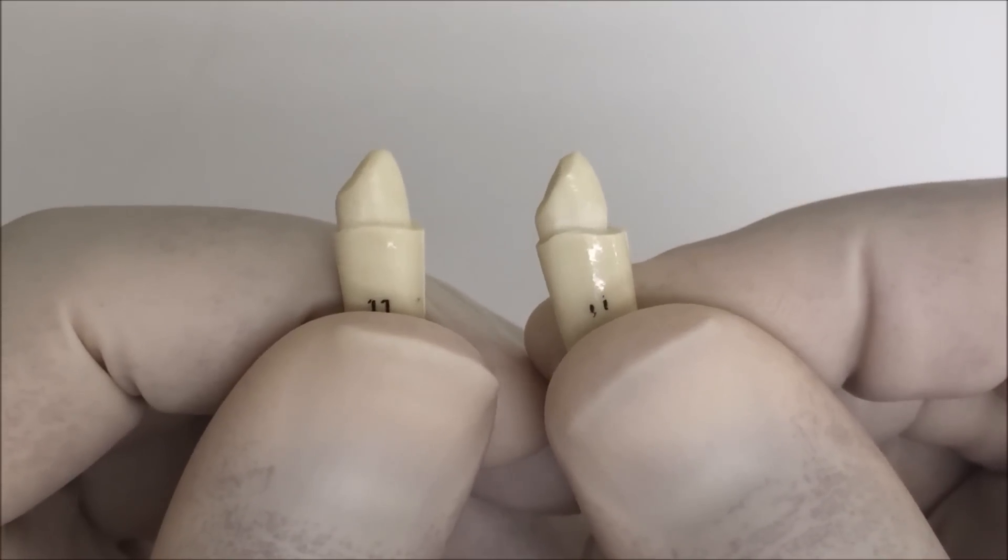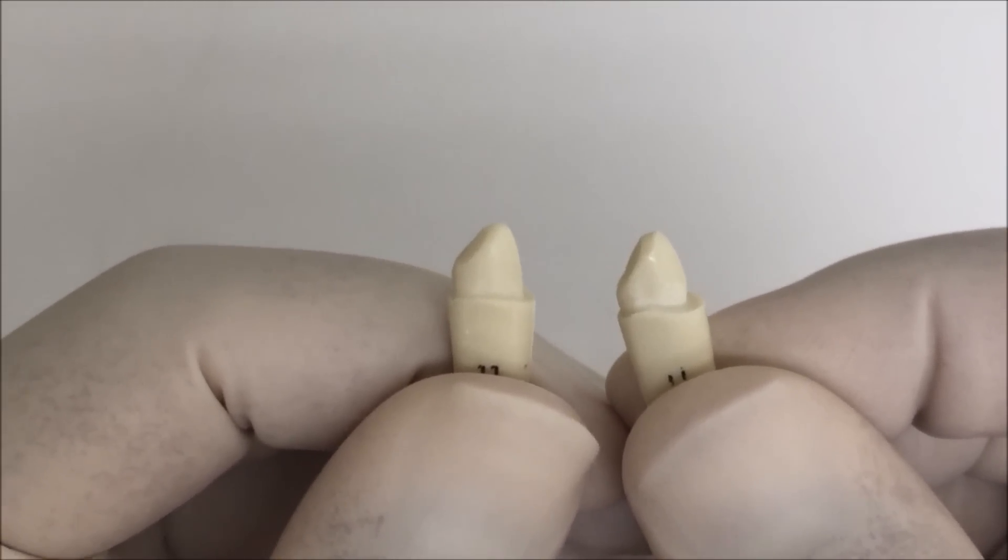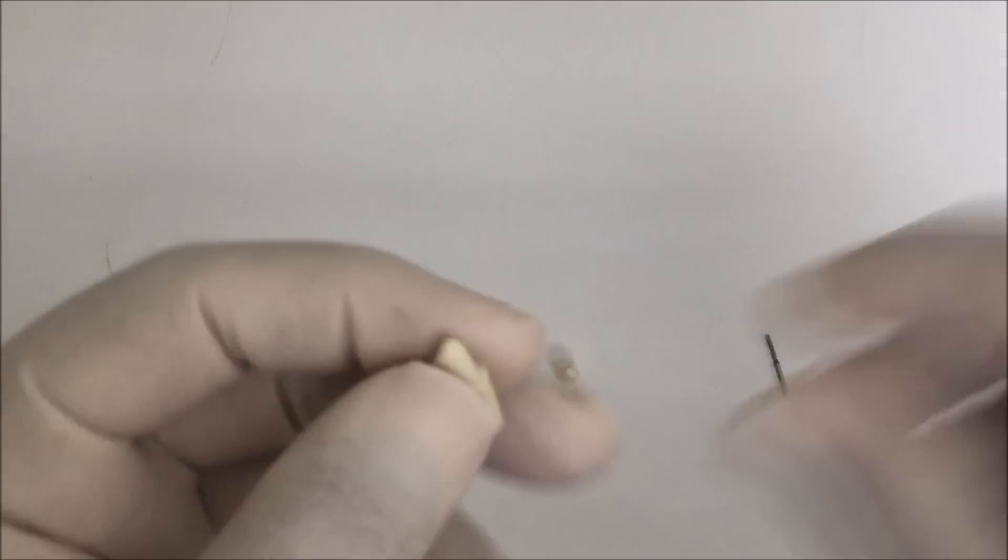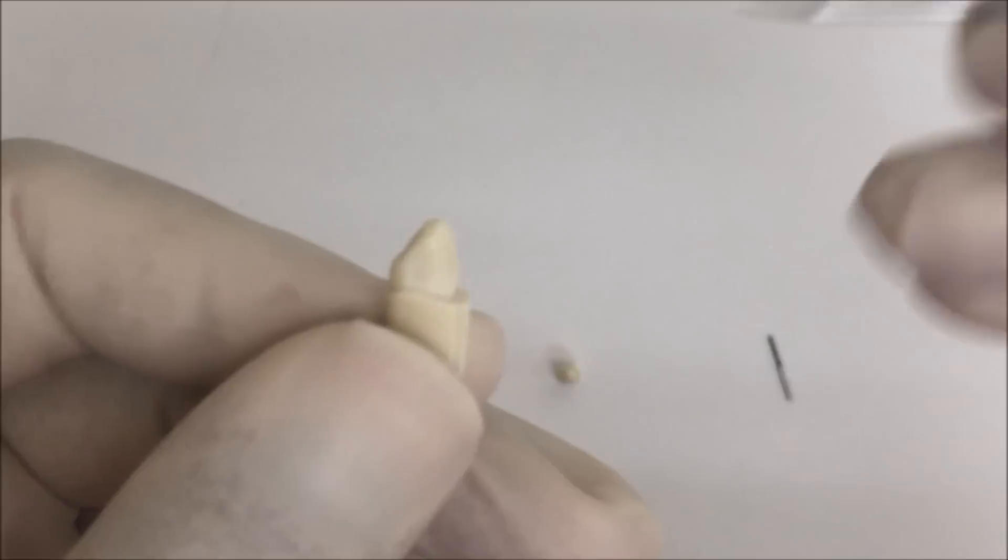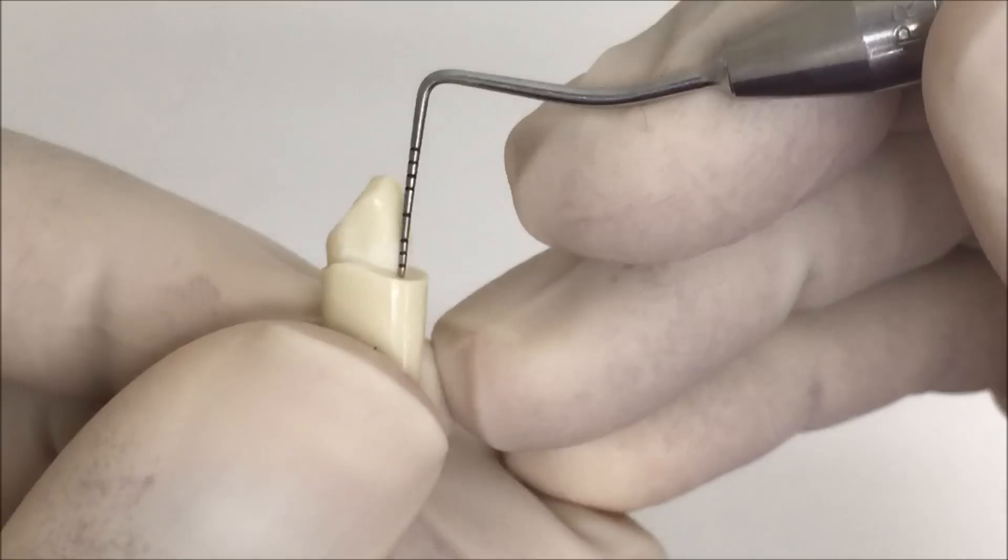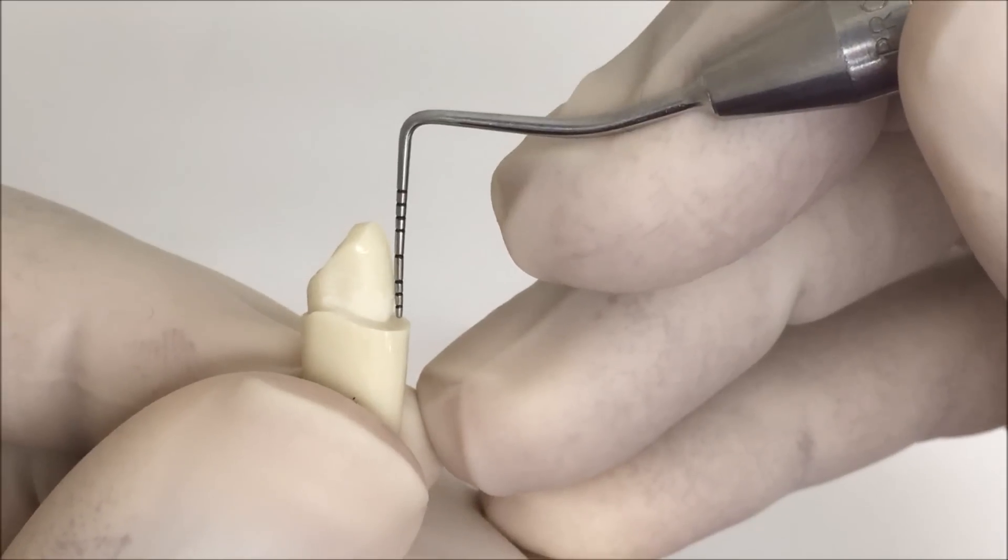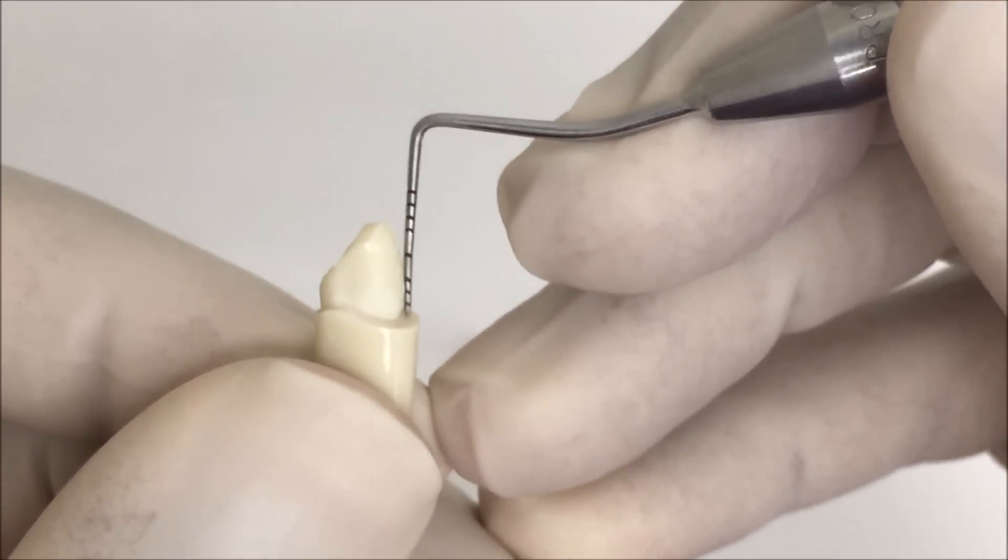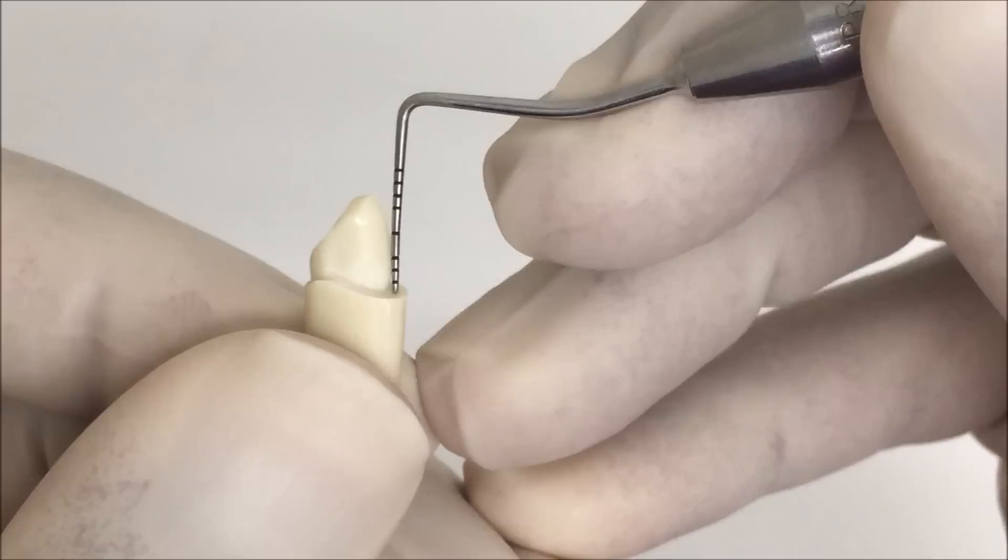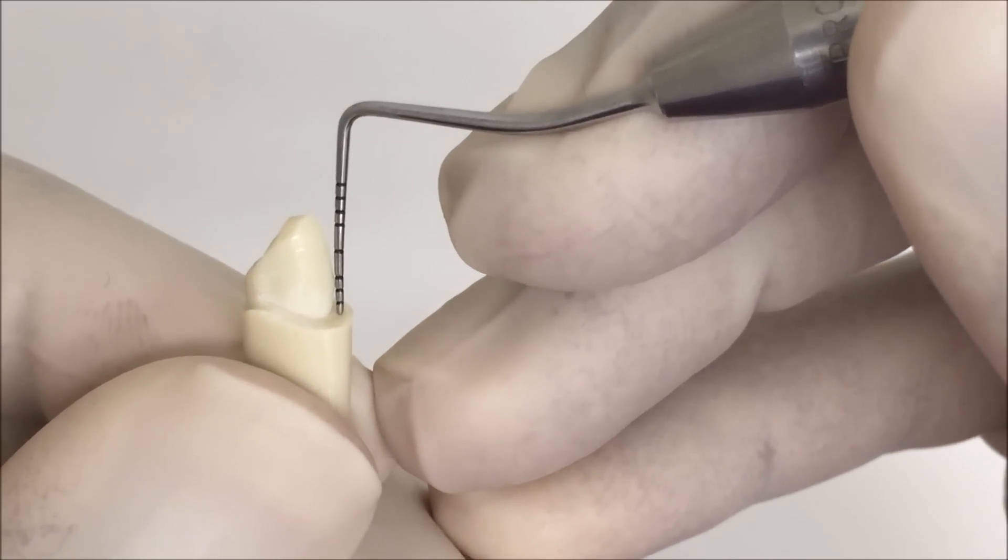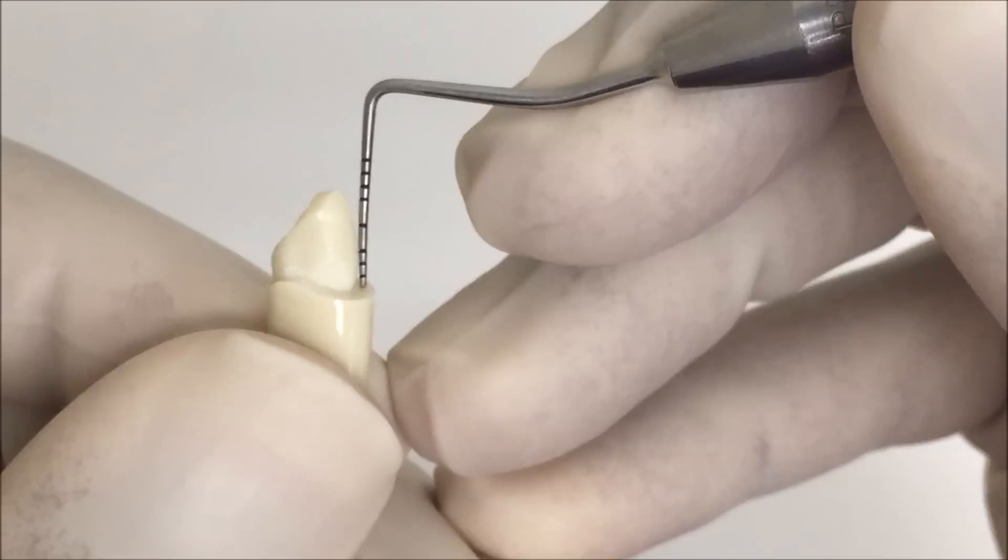Coming back to the first method, which is using the instrument: by putting the instrument parallel to the cervical third of the tooth, you can see that it is not completely in contact with the surface. You can see there is a small area near the margin that makes a triangle with the instrument. So in this case, you can see there is an undercut.